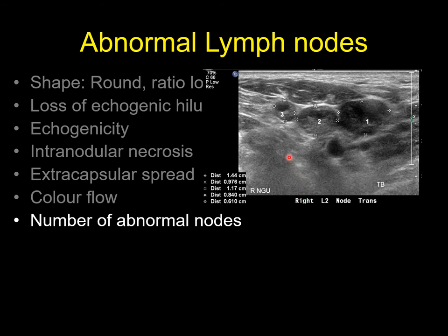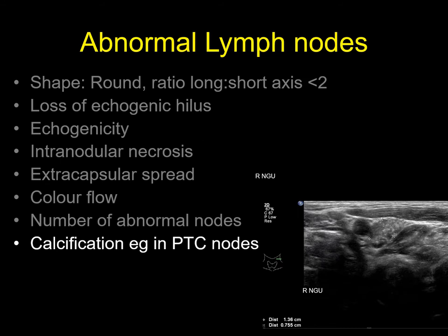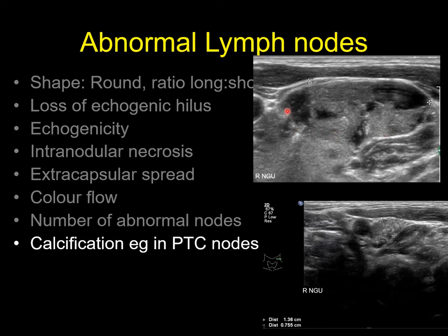If you spot numerous lymph nodes at various levels of the neck all looking very much the same — abnormal, enlarged, or necrotic — then there is likely to be a pathology present. Here you can see a very large-looking lymph node, larger than usual.